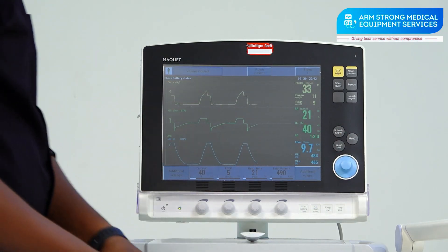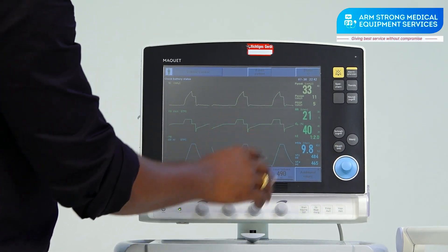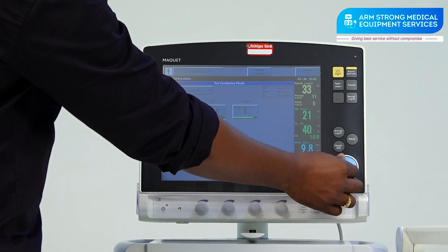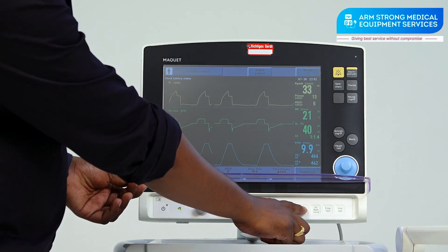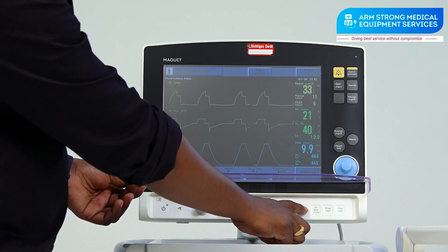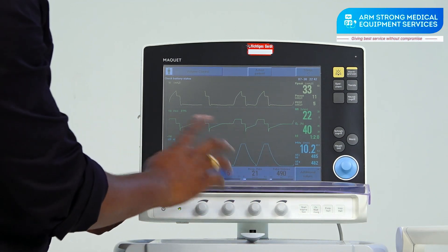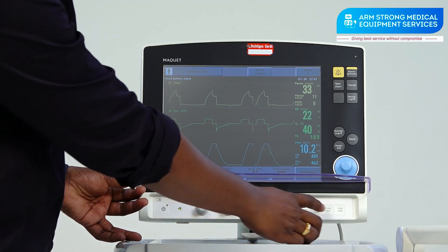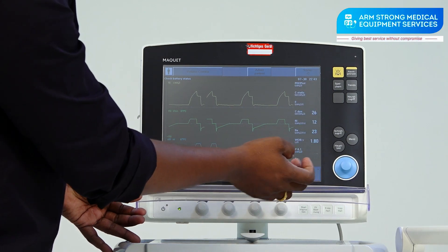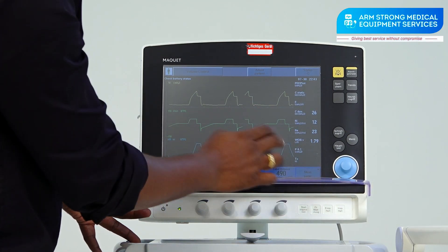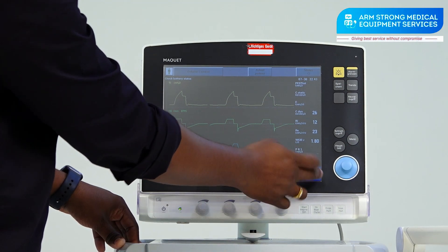This is the rotating encoder knob — whatever setting you want to adjust, you can use this knob instead of the touch screen. Here we have O2 Breath and Manual Breath. O2 Breath means for 2 minutes oxygen will go to 100% and the ventilator will deliver 100% O2 concentration. This is the Inspiratory Hold and this is the Expiratory Hold — used for static compliance measurements, work of breathing, resistance calculations, and tube compensation.